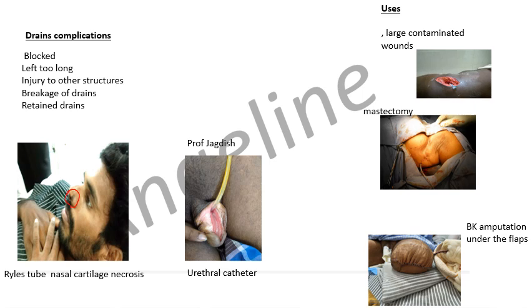And this was sent by my professor. This urethral catheter was left for too long, either because of neglect or patient socioeconomic problems. This catheter was left for so long that the whole of the urethra, that is the ventral part of the urethra itself, has got necrosed. This is very important. So it has got necrosed.